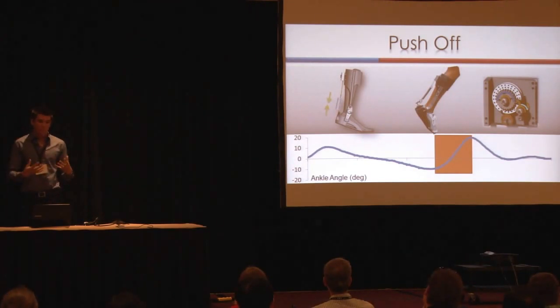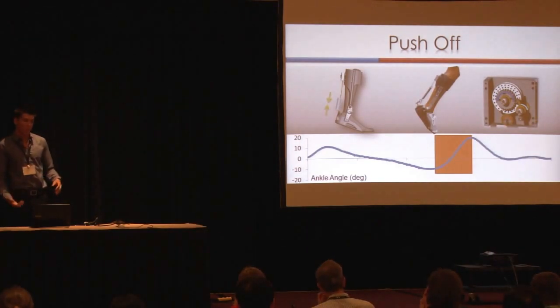At this point, our system disengages, which allows free rotation during the swing phase of walking, which we feel is very important for reductions in metabolic cost.